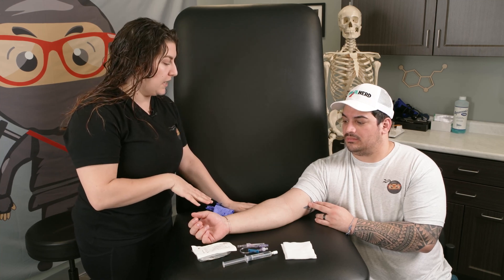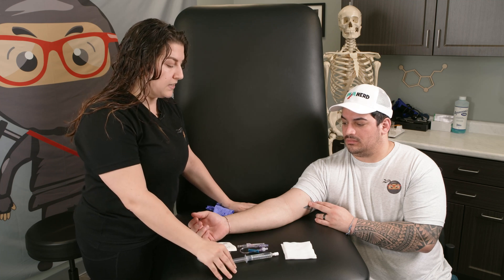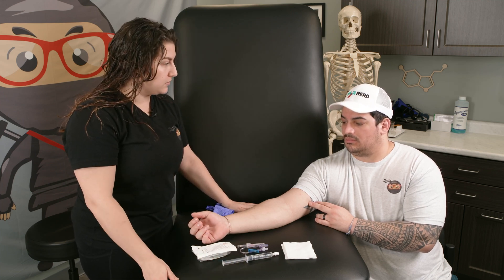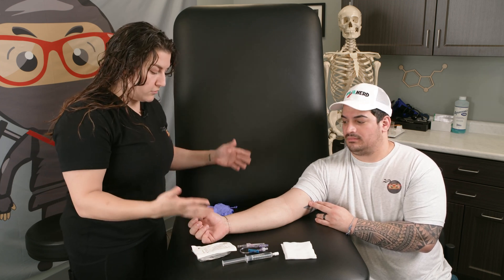We're going to be starting an IV on you today. We're going to get some blood work, and an IV is an intravenous catheter — it's a little straw that goes into your vein so that we can give you medications. Once we do that, we're going to grab all of our materials and make sure they're here with us.